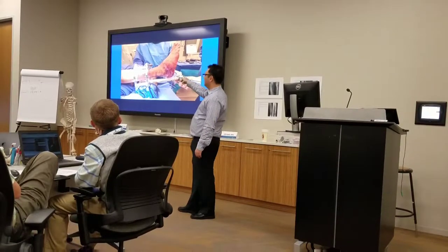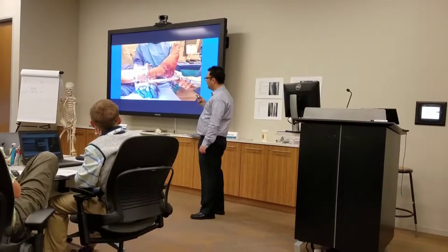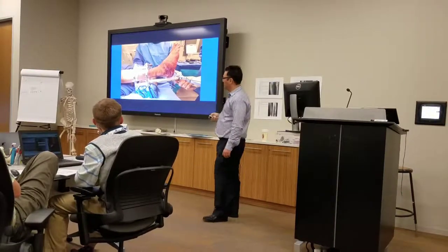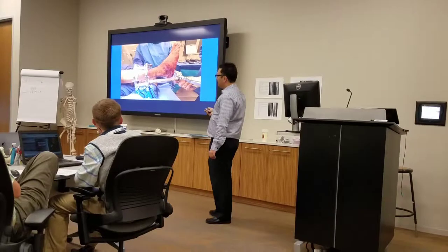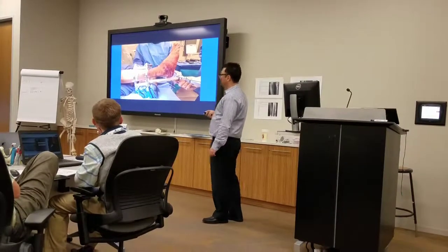I'm always using a double ring construct for the Charcot deformities. I typically still like throwing that wire first instead of doing the half pin straight down the tibia. But Dr. Laporta, Dr. Labbe, they're throwing the half pin straight down the tibia. It may save a few minutes. I don't know, I'm just so used to doing it the other way.